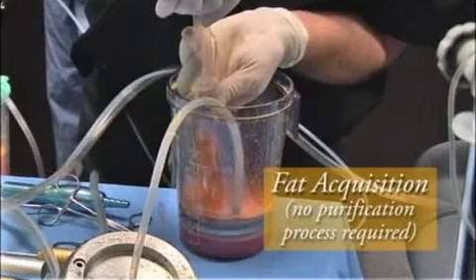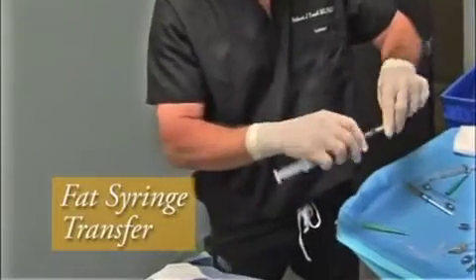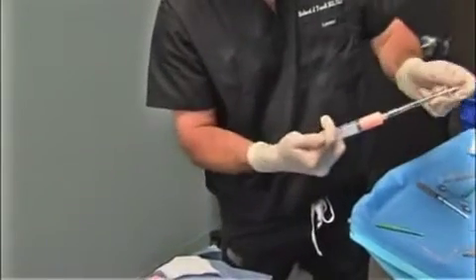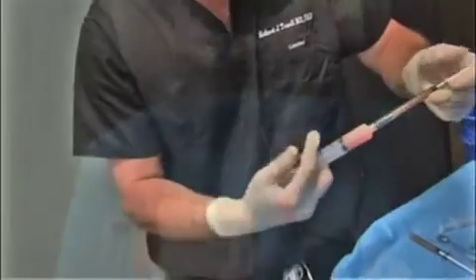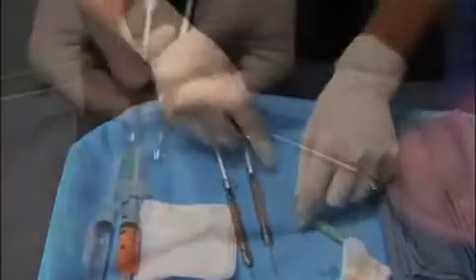The main advantage of the body jet is that fat acquisition occurs with no purification of the collected fat. The fat is collected by a 10 or 20 cc syringe and transferred to 1 cc syringes for injection in the face or body areas.